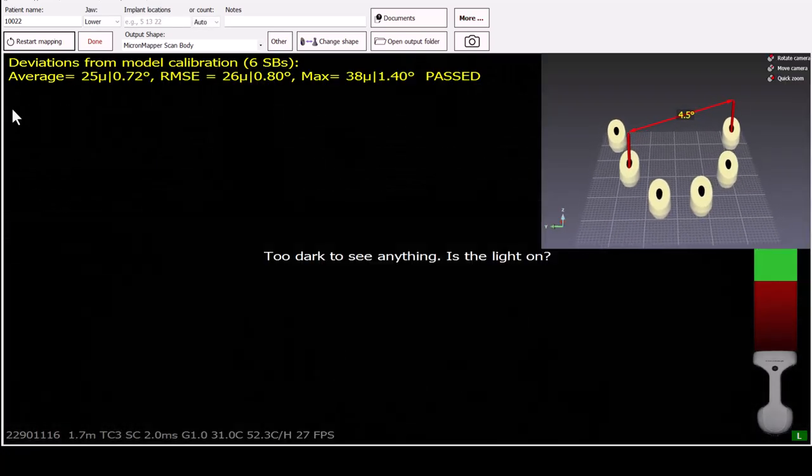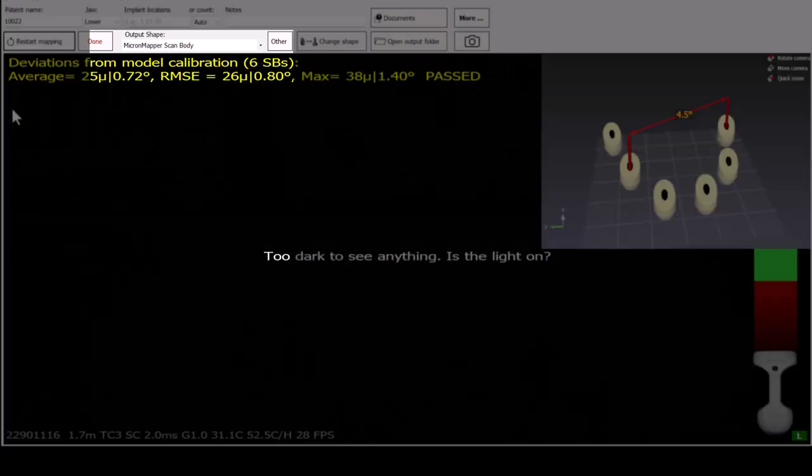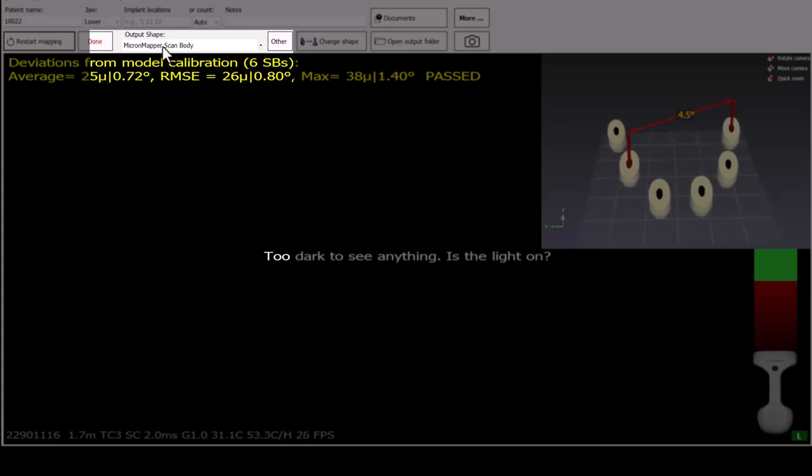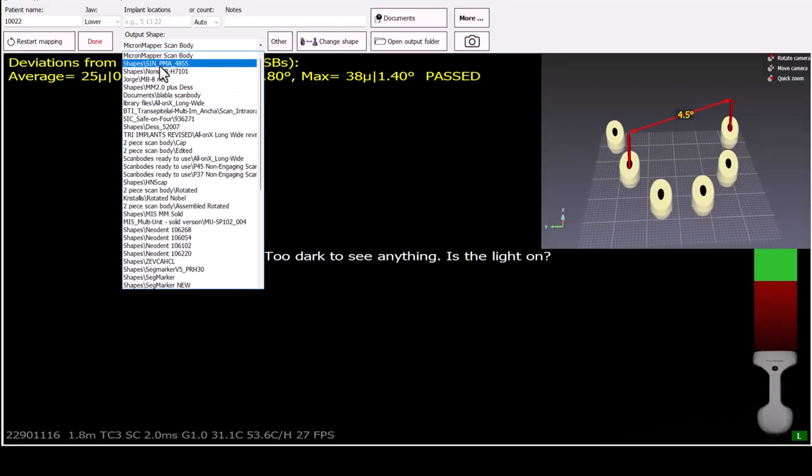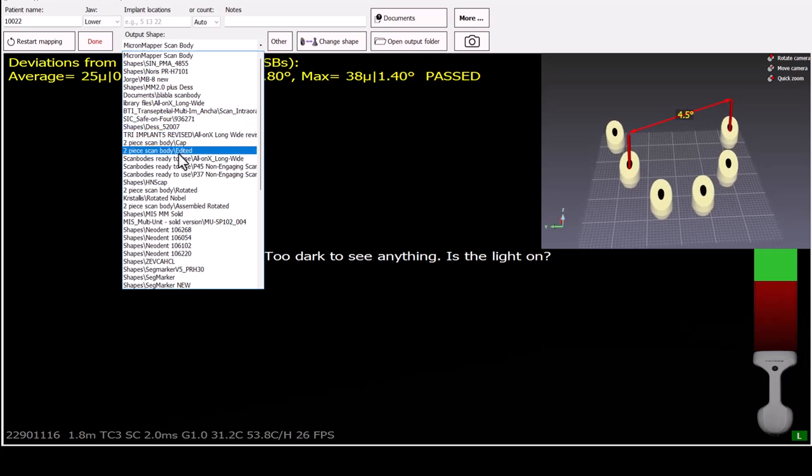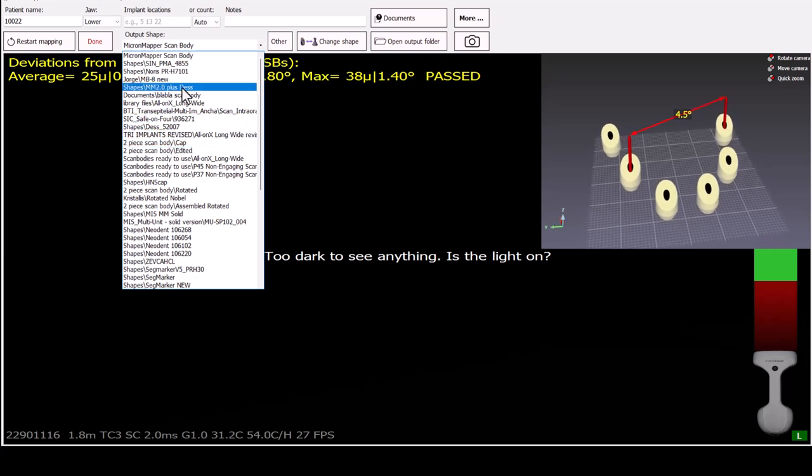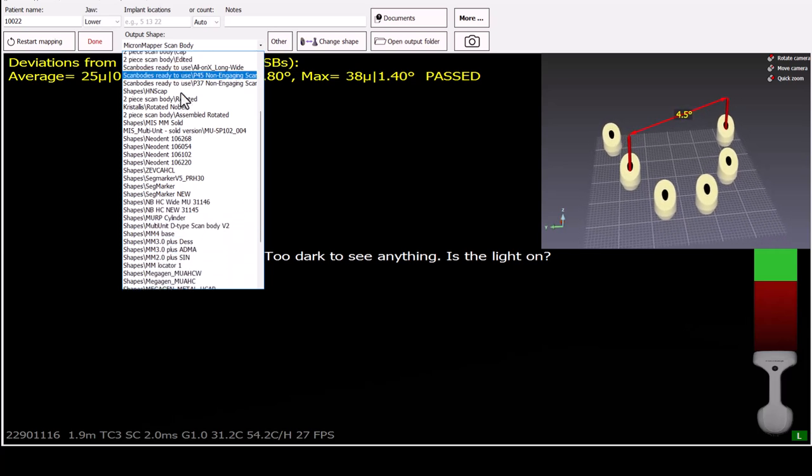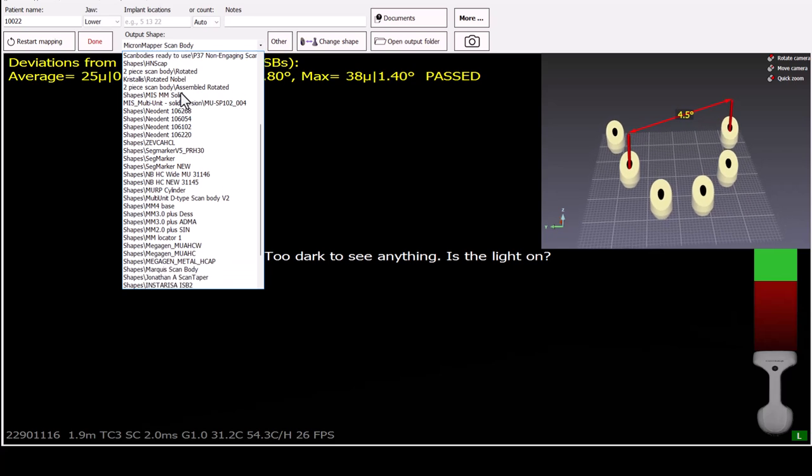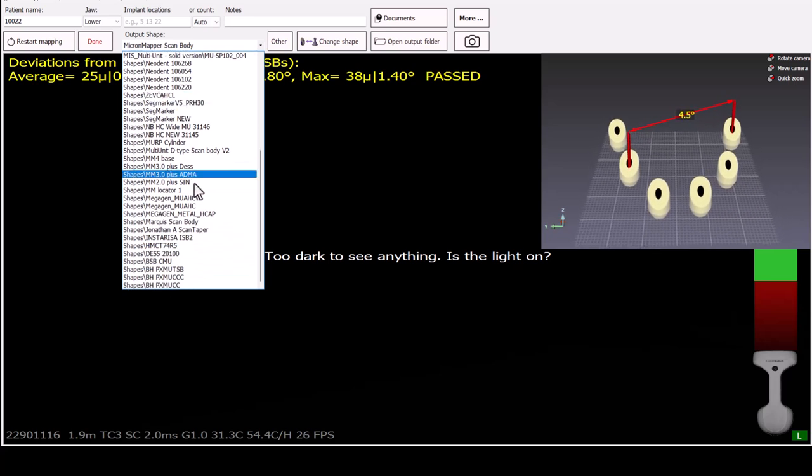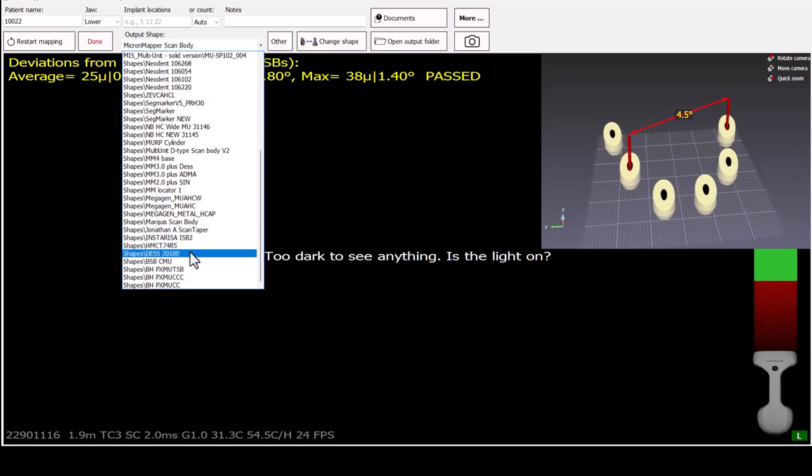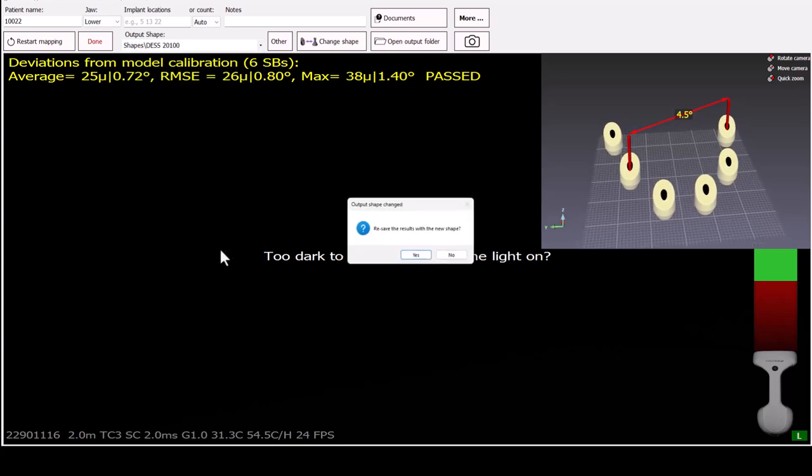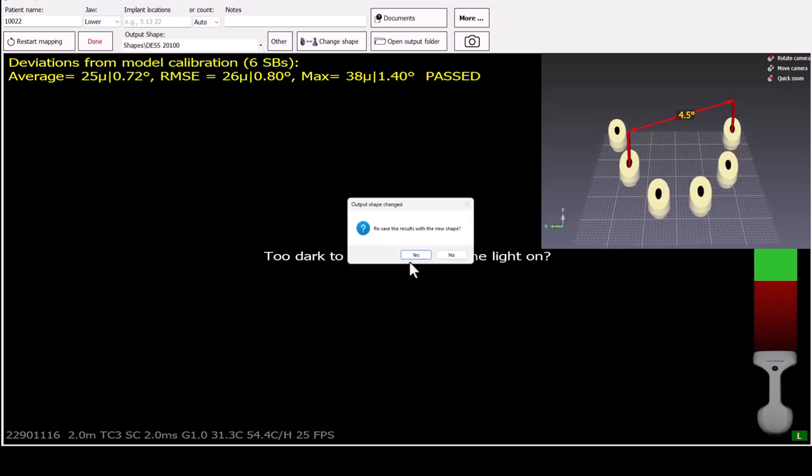To generate the output in different shapes, select the desired shape from the preloaded list and a drop-down menu. Selecting any of the shapes will generate a separate STL file with the flags as marked in the software. Once selected, confirm your choice and evaluate the result.